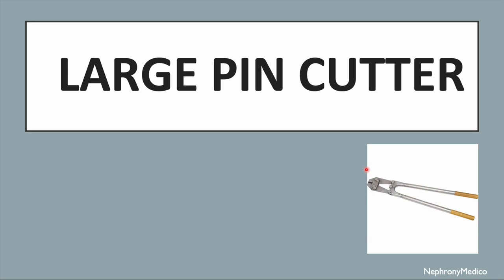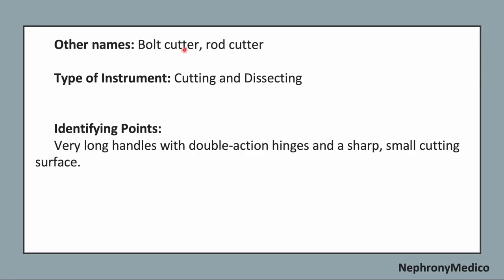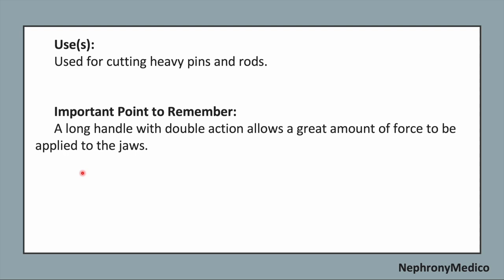Let's talk about large pin cutter. This is a picture showing large pin cutter. The other name of this instrument is bolt cutter or rod cutter. It is a cutting and dissecting type of instrument. Now, identifying points. It has very long handles with double action hinges and a sharp small cutting surface. Use. It is used for cutting heavy pins and rods.